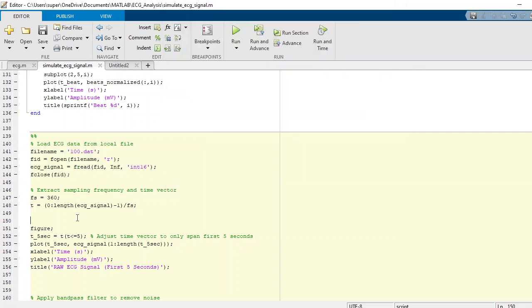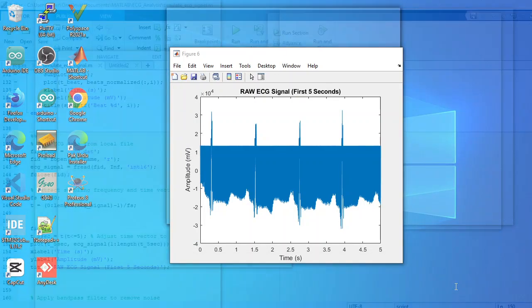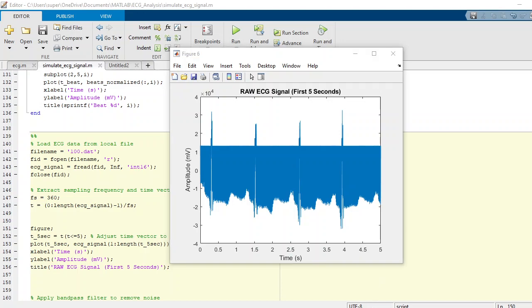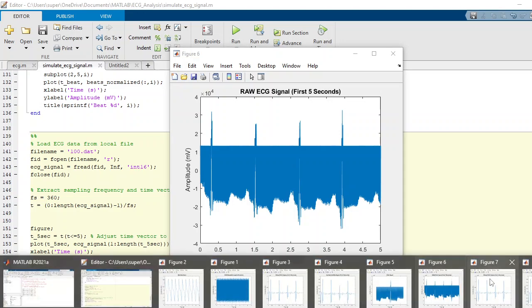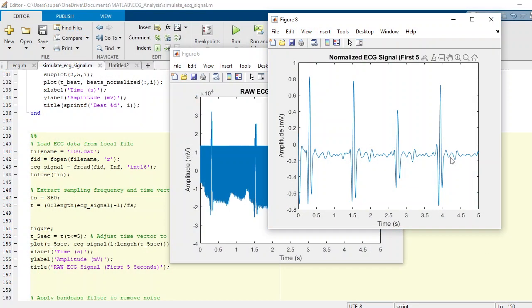So we just selected the five seconds data and we named it raw ECG signal. This is the five seconds data of the raw ECG signals, but here you can see that once we filtered and normalized the data, it will look different.